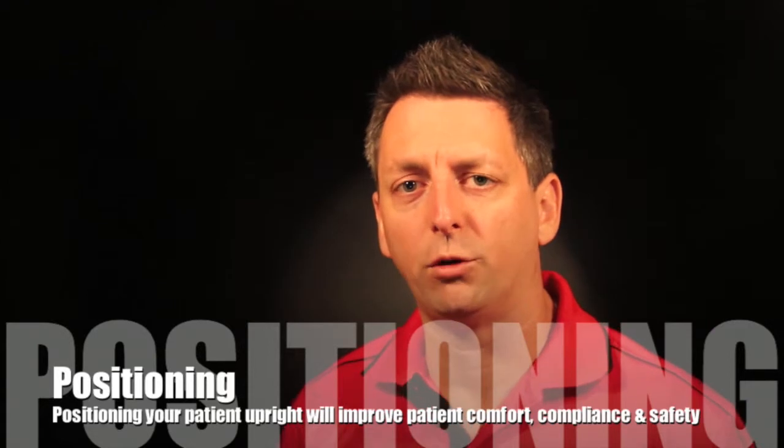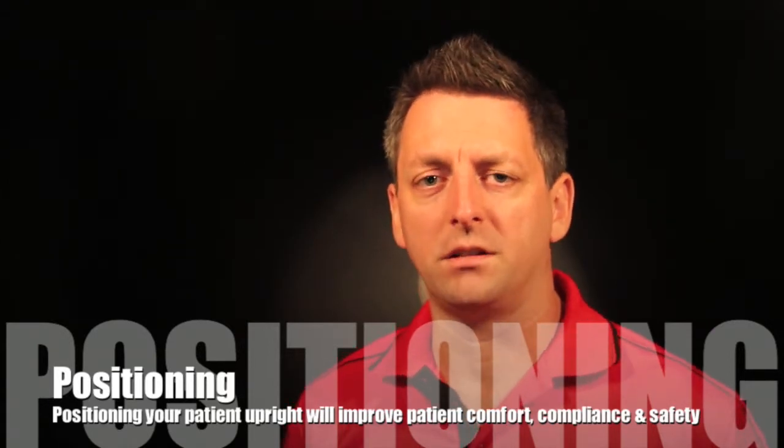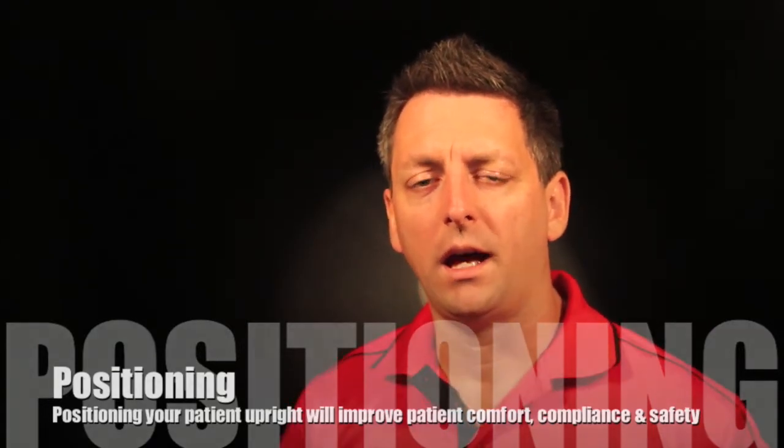Positioning a patient, like I said before, the best position is sitting a person upright or even a little bit forward so they get good lung expansion. Also sitting a person up matters because they have increased air going into their stomach, and they could aspirate.